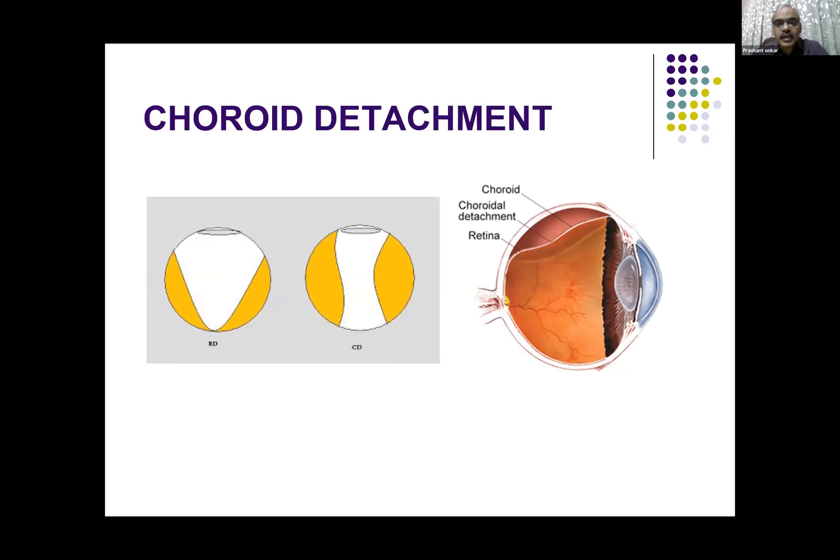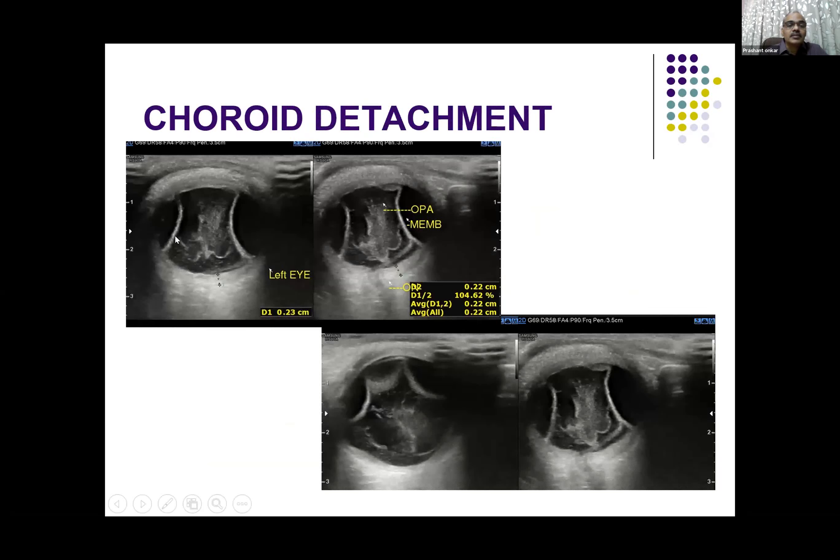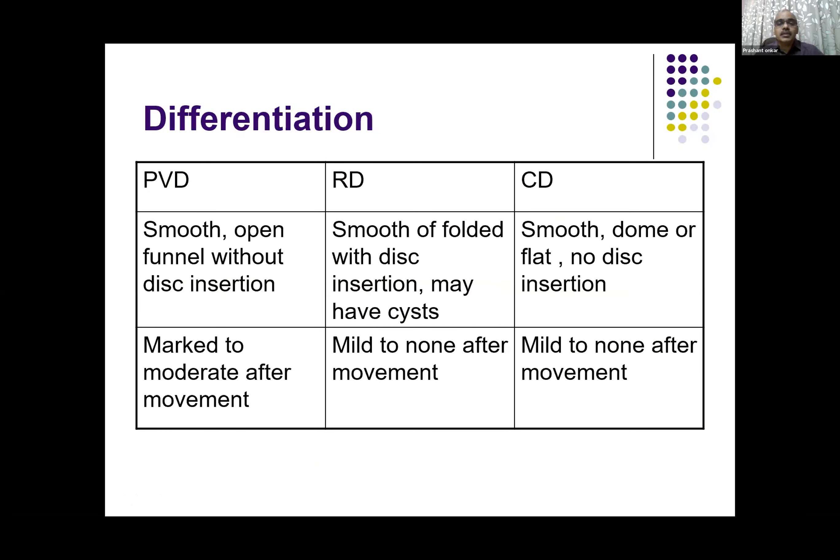Coming to choroidal detachment — not that common, associated with severe inflammation or severe trauma. It typically shows a rounded convex format on B-scan, as against the V-shape of retinal detachment. This is an example of vitreous hemorrhage with a partial choroidal detachment. You can see the choroid has buckled — this is very classical choroidal detachment on both sides. There are membranes inside with internal echoes, and the retinochoroidal complex is thickened. This is secondary to inflammation — that way you can give information to the ophthalmologist whether this is inflammation or trauma.